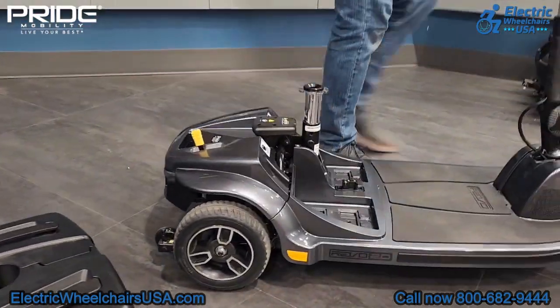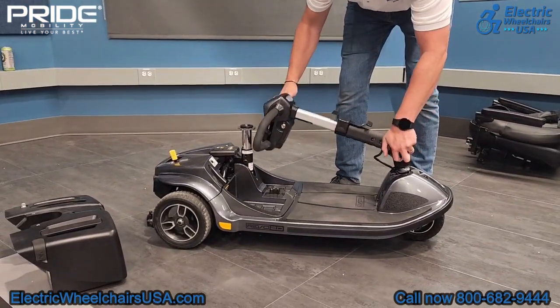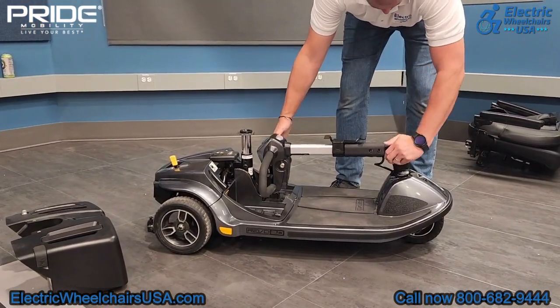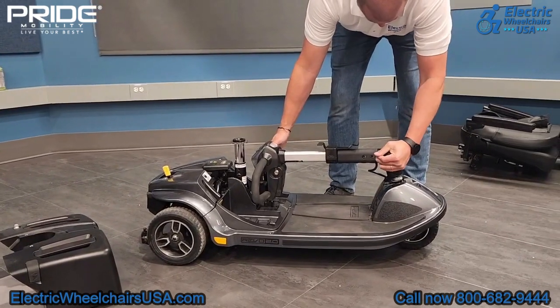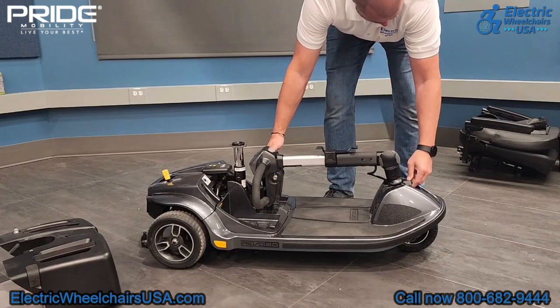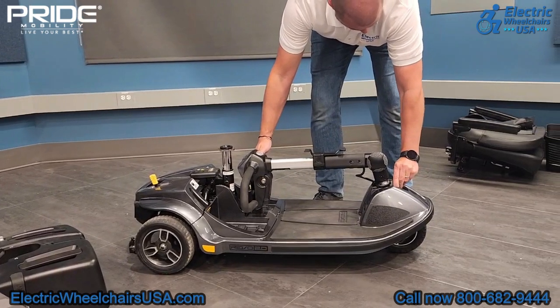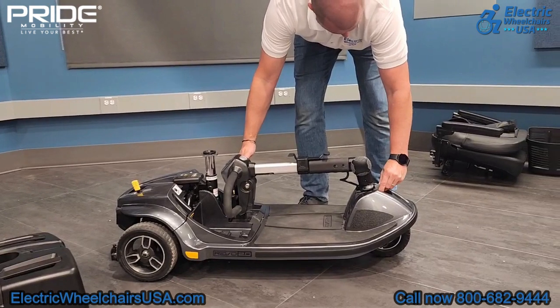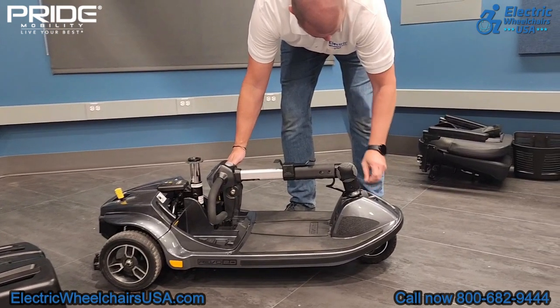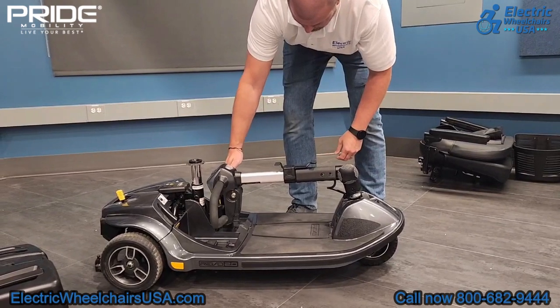The next step is you would use the adjustable knob to adjust the tiller, and you want to adjust it down to where it's about parallel with the floorboard, and then lock that into place. After you do that, there is another knob that is located right below the adjustable tiller knob. This is a locking mechanism that will lock the wheel in place. So if you were to transport the scooter, you don't have to be concerned with the tiller jumping around. This will just ensure that it stays in place.